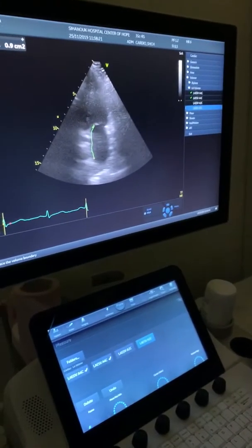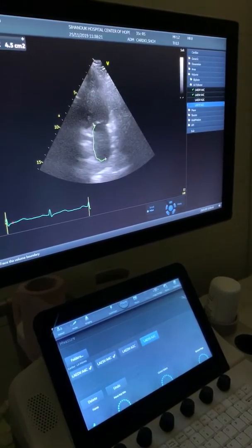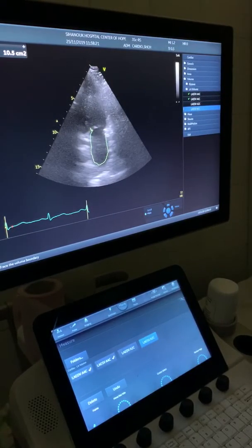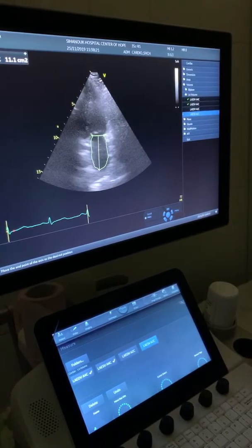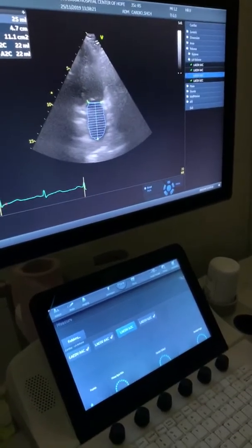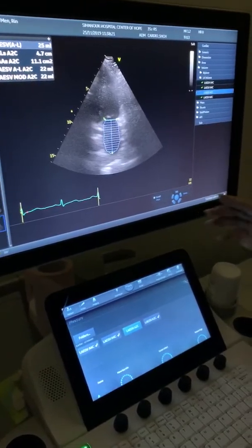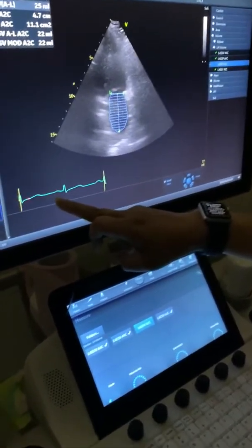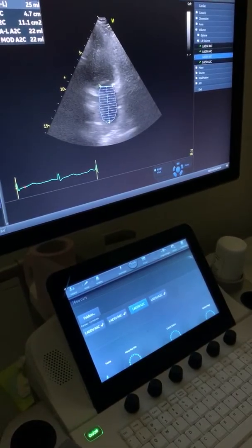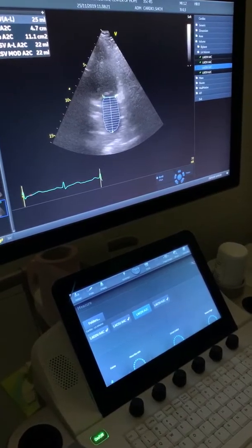Volume. Sorry, I'm pointing it out. Good. Check now your 2 chamber. Yes. Okay. Then go out. Now measure your image. Diastole again and systole, doctor.